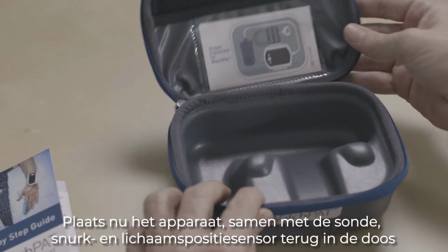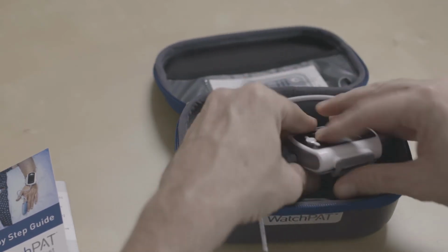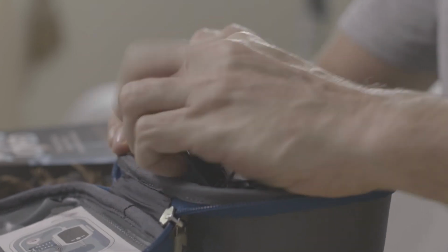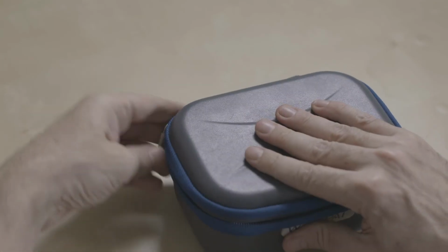Now, return the device along with the probe, snoring, and body positioning sensor to the case. And finally, return the illustrated guide to the case.